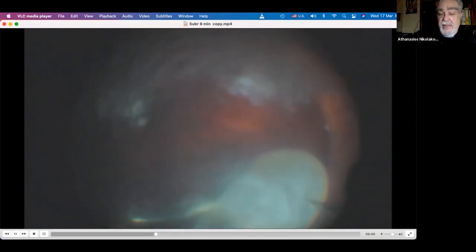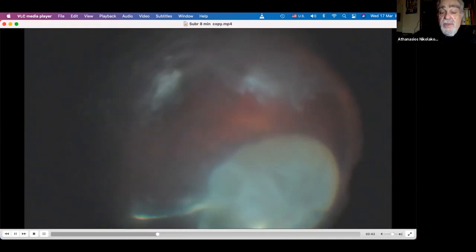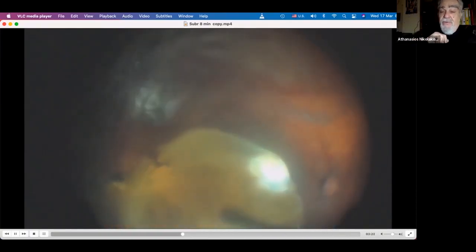But this is a very, very strong one. And now we try to use something like a chopping technique. I'm going to get a little bit faster. I'm using phaco fragmentation. The other hand is very helpful because it's holding the lens while you're doing phaco, to do it continuously without letting fragments or the whole thing dropping back and forth, which is not damaging the eye anyway, because when you drop pieces on the surface of the retina, you don't do any damage.